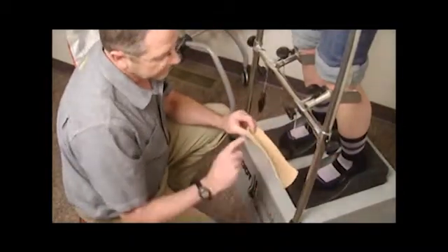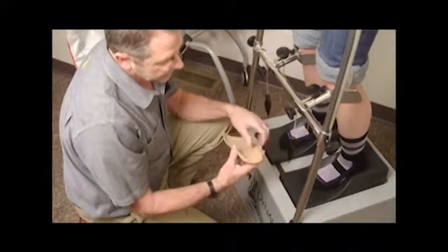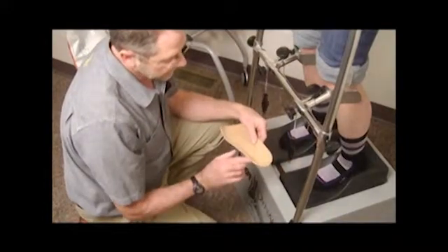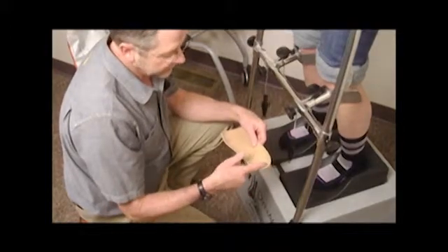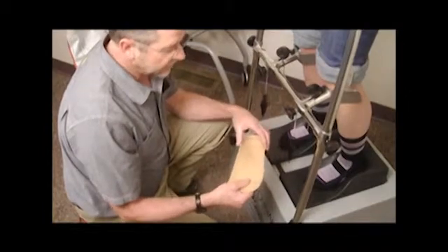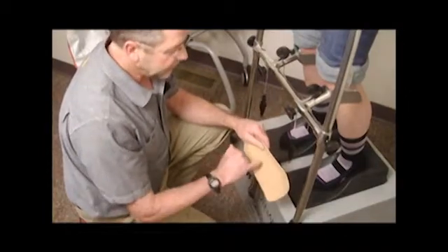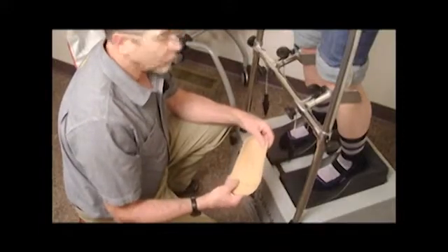Now you'll notice that we have a nice arch profile, nice deep heel cup, nice and tight to the heel. No wrinkles in the back, and that's a function of not having the heel too far forward. So this is now cooled. You can set it aside. We're going to put the patient name in here and your facility, and then we're going to go ahead and mold the other foot.